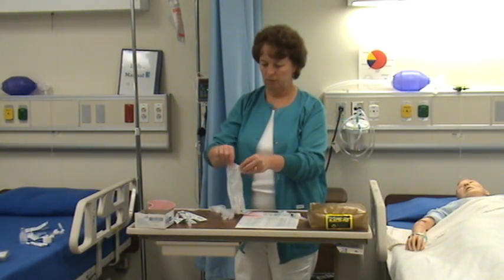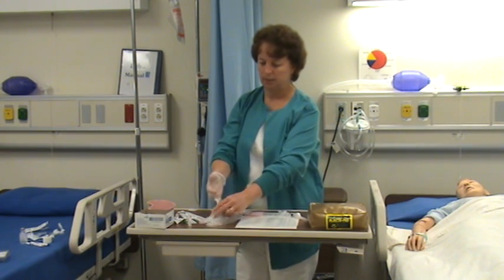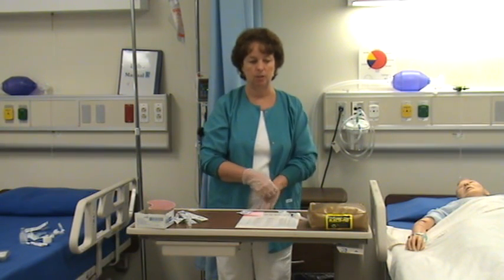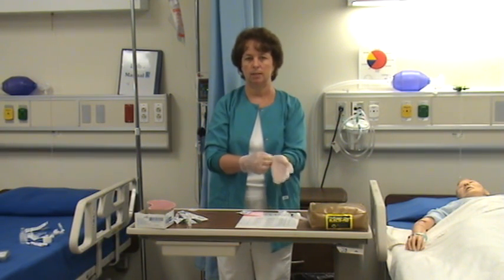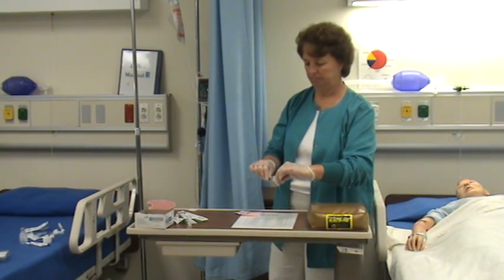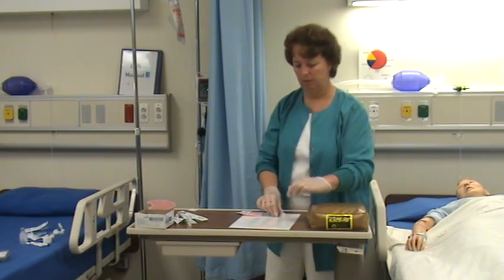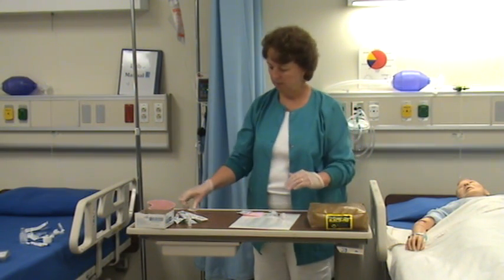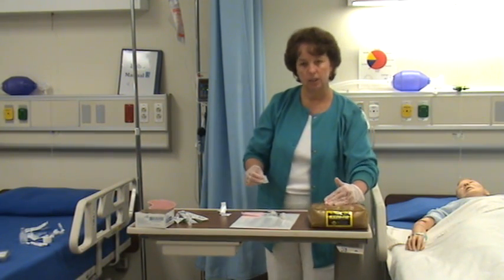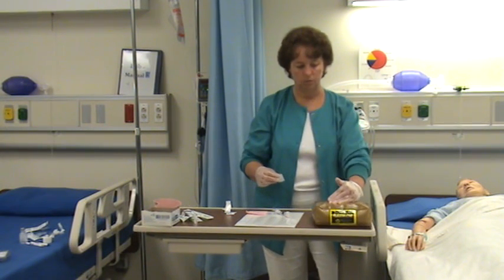I'm also going to demonstrate the Z-Track technique when administering the IM injection. This could be given in the deltoid. The way you do the Z-Track is that you pull the subcutaneous tissue out of the way — I pull it towards me. I take my alcohol swab, pick my site, and clean it starting from the center going around. Hold onto that pulled tissue.